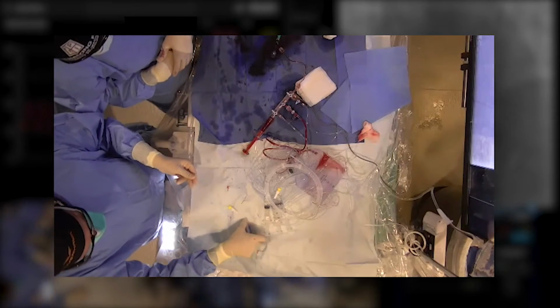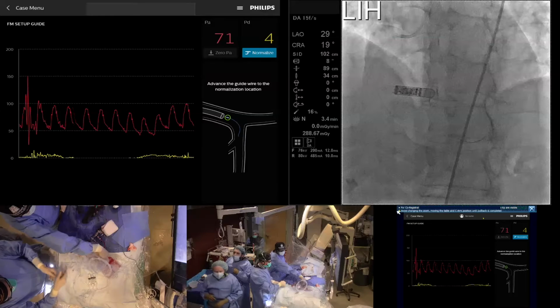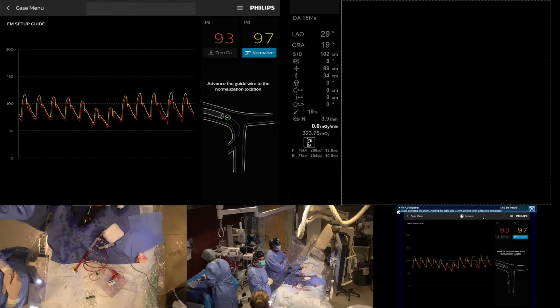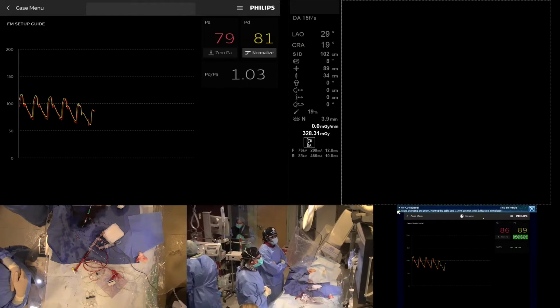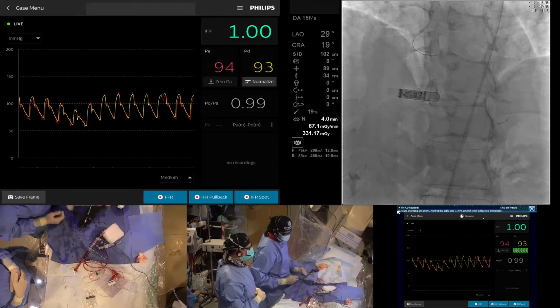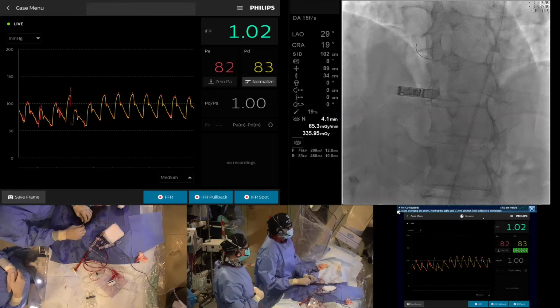I think it's a little, to be honest, I think it's a little easier. And now we can hit normalize, please. That should be a good equalization at 1. Good. And now I would say put it in the other branch, right?